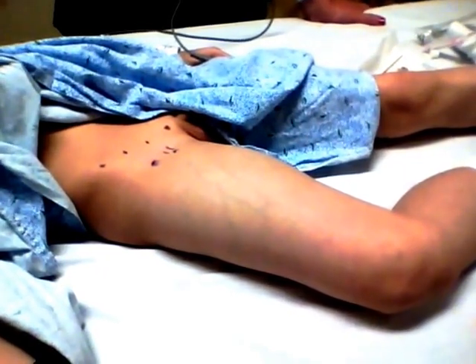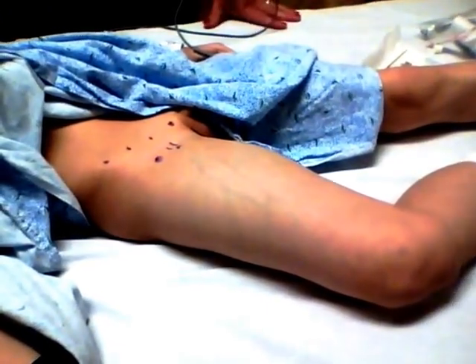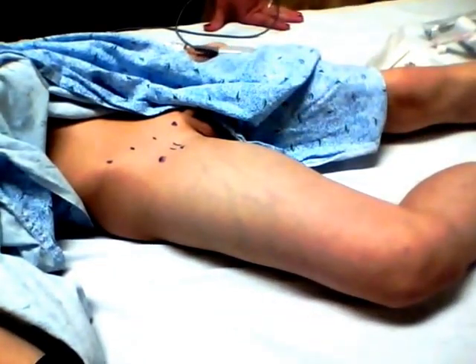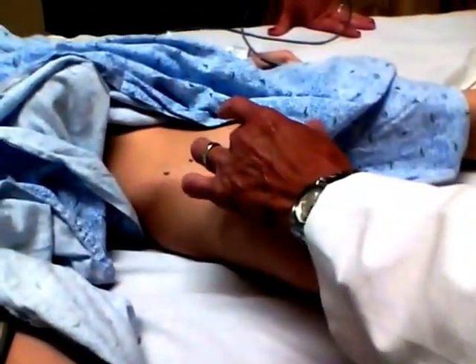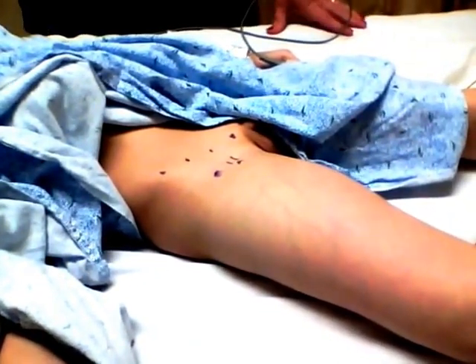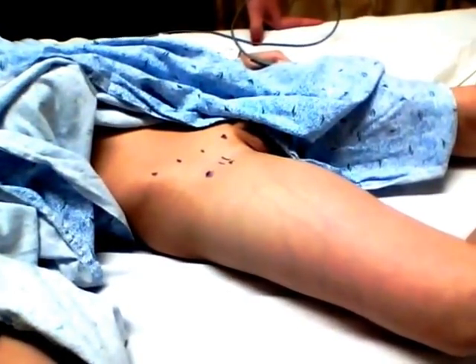The fascia iliaca block works not as an actual nerve block so much as a field block. We're going to put an injection of bupivacaine into the fascial plane that forms around the femoral nerve. It's going to block him up higher rather than right at the femoral nerve itself. You can also block right at the femoral nerve and that works fine, but in his case this seems to work a little bit better.